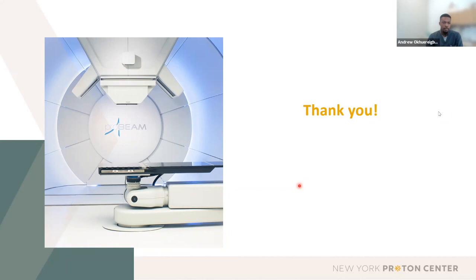And we've also worked on making the treatment a little bit more efficient. We step out of the room now when we do our SDX treatments, and we just go in to do a clearance check of the CTT or check to see if the patient's okay. But we do all of our imaging now outside of the room, which makes things a little bit quicker. Of course, we have a staff that we trust and we've trained in one of our gantry rooms that's aware of everything that needs to be done for SDX treatments. But because of the number of gantries we have and beam wait time, we determined that 45 minutes is the best time. We've gotten a lot of data from our physics team, and on average, SDX patients are being treated around 40 to 43 minutes.